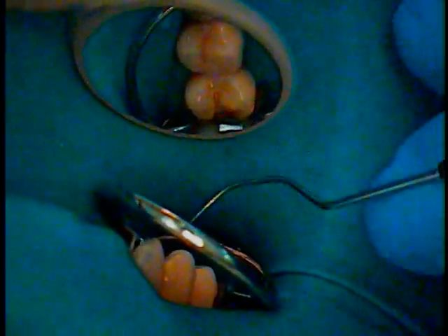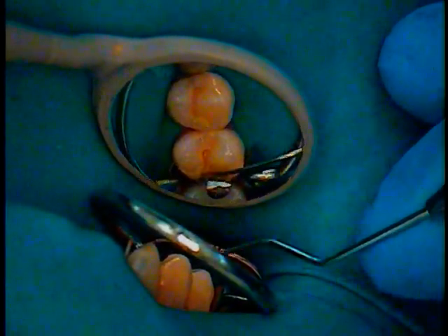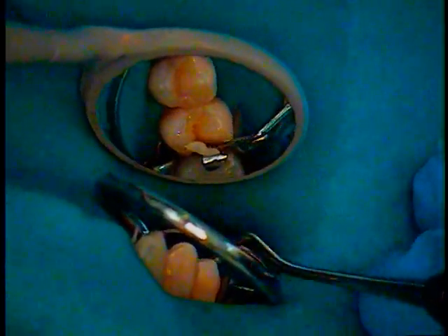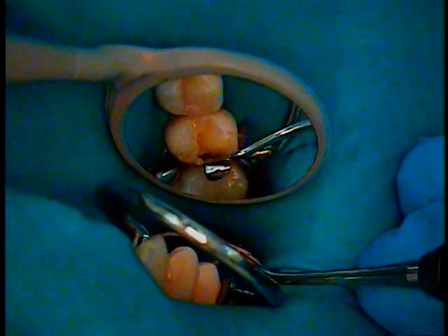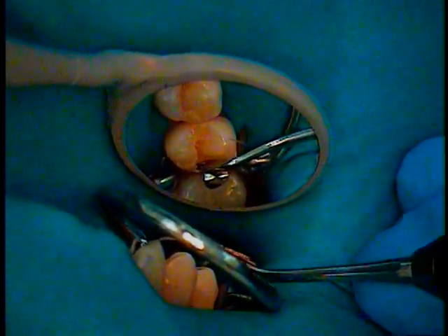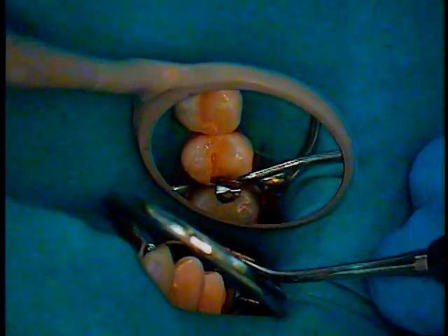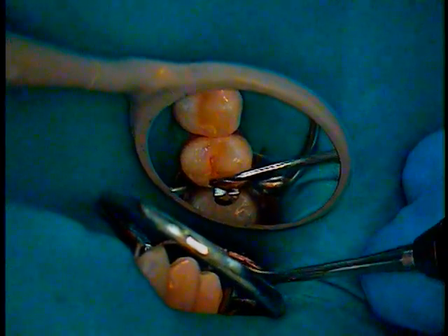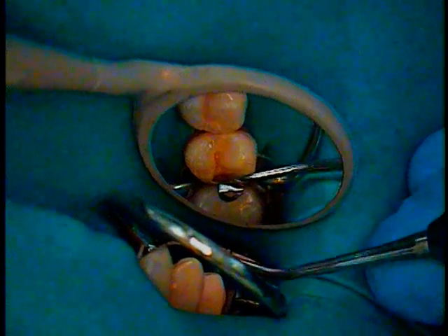Okay, I'm okay with that. I'm going to spread it a little bit. That'll go up the side near the margin, right in with my smallest piece of material. I'm going to go right in there with the small condenser. This is a Hollenbeck. I'll push it in place gently up against the distal wall, which is metal. Distal wall is not part of the C factor, or is it? It's up against enamel and dentin. That's the C factor. So go laterally.